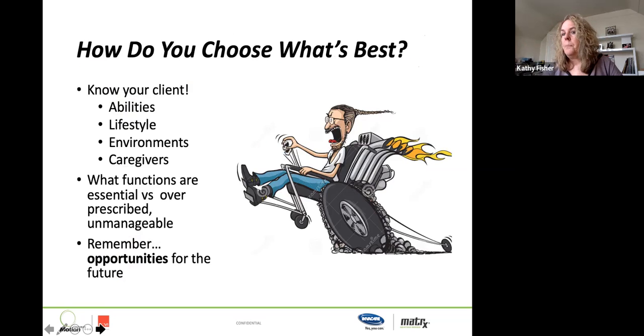So just to wrap up, how do you choose what's best? There's tons out there. We've just thrown out all kinds of ideas. You need to look at the whole situation, the client, their abilities, their lifestyle, who's involved with them, and again, is something, are you overprescribing or is it unmanageable? Are you offering an opportunity for someone to have better function and a better quality of life?